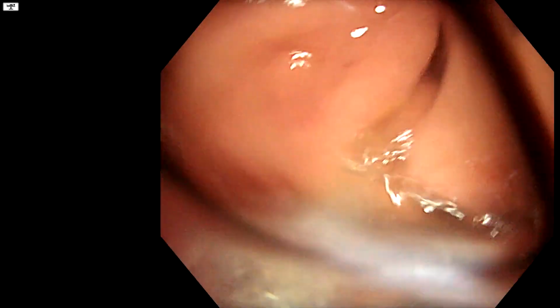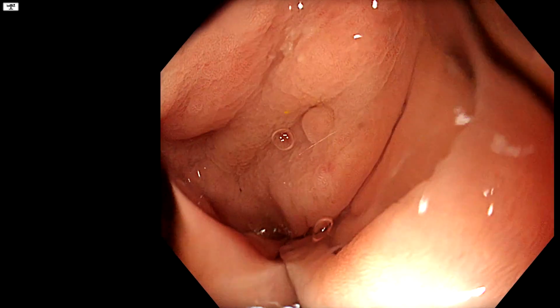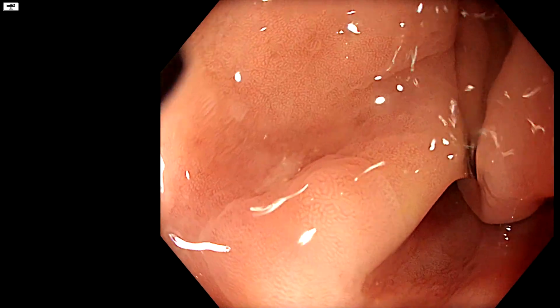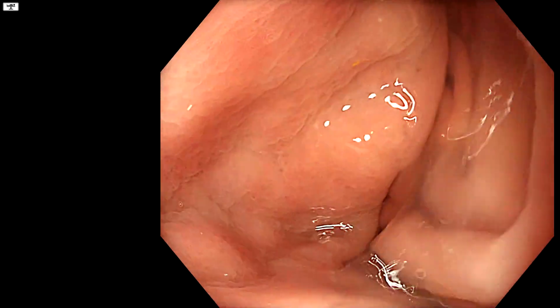But if you sit the tip in the fundus, if you want to expand that, which you definitely should do because it's flat things we are missing in these patients, then you can also get that to expand. But you do really have to put the insufflation in that area, sit on it. Right now I have a tubing here for the therapeutic procedure we will perform on that low-grade dysplasia, so it is not distending as much as potentially a standard tubing would do. But you can see that at least you can get better views if you do proper distension.